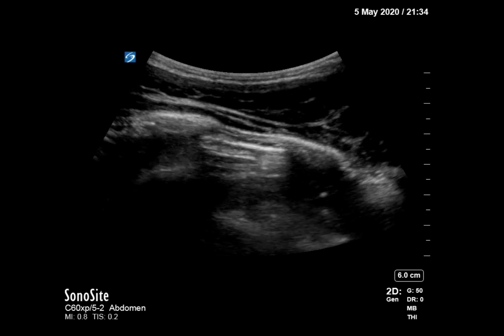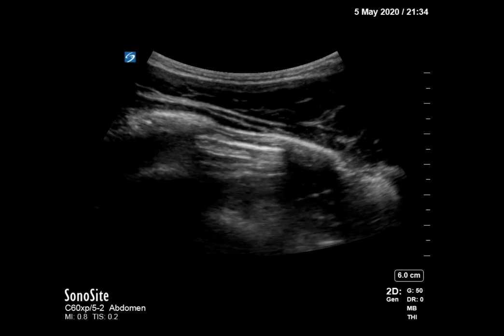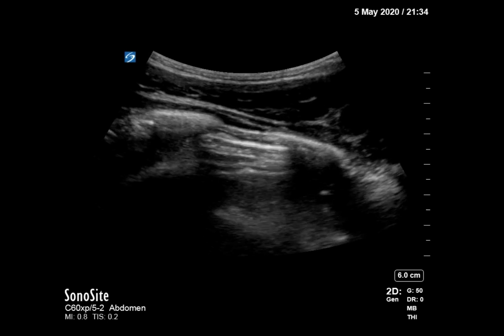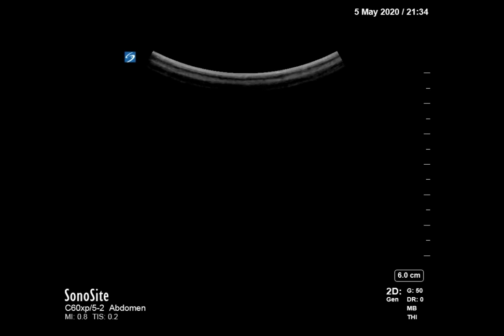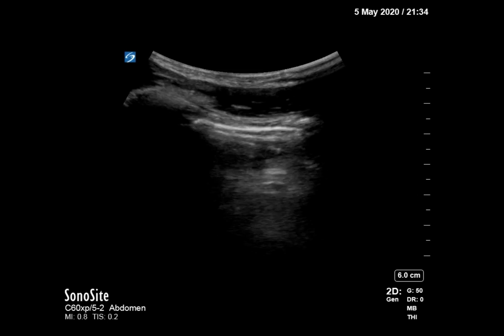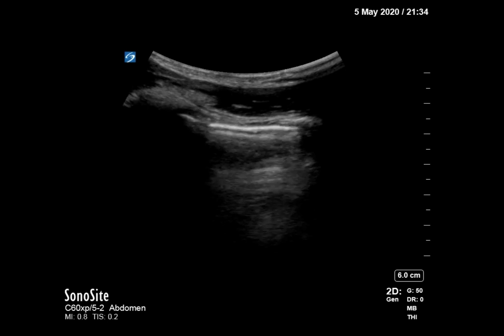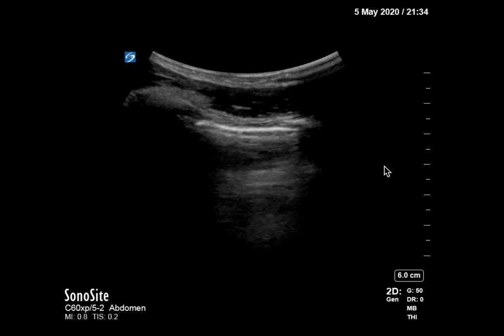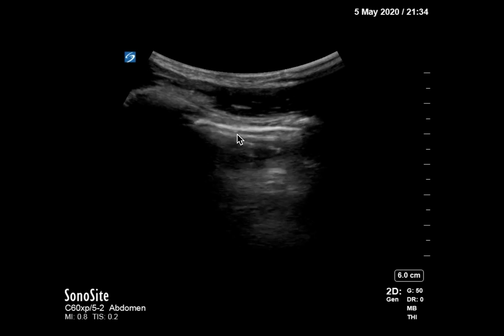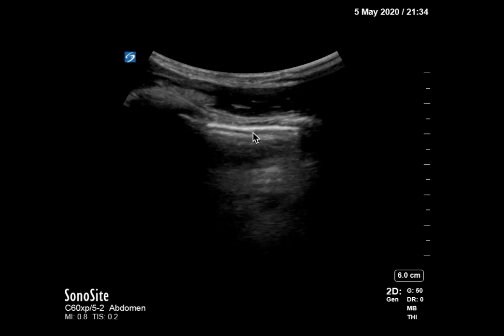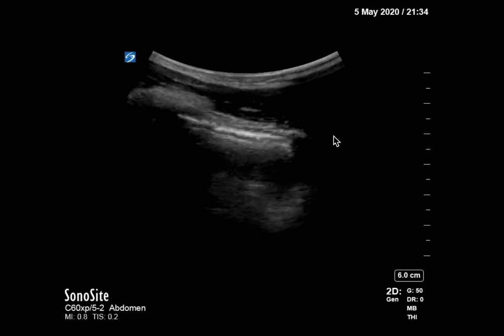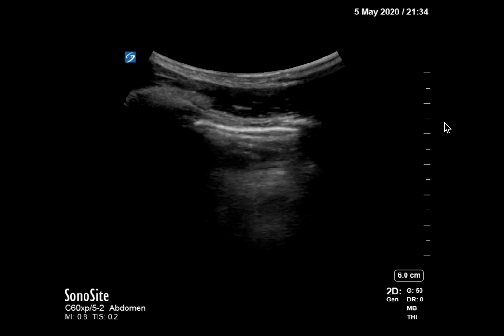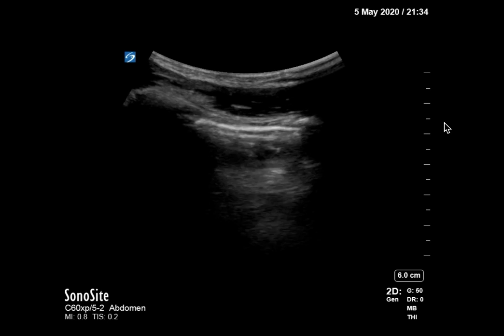Just to double check, we went to the left side, which is asymptomatic. You can see the pleural line sliding back and forth as the patient breathes — they call that an 'ants marching' or shimmering view.